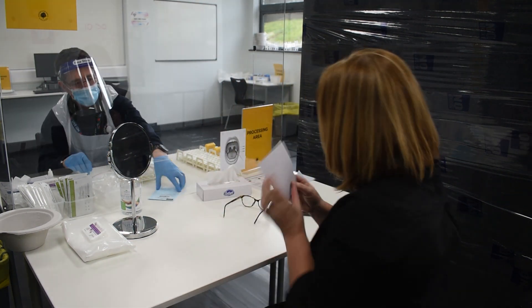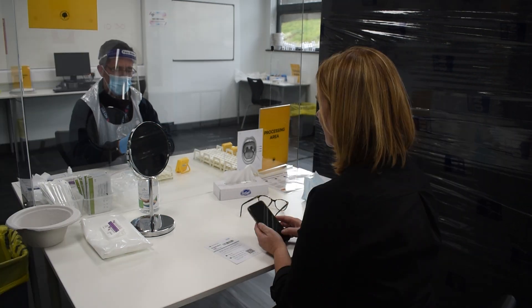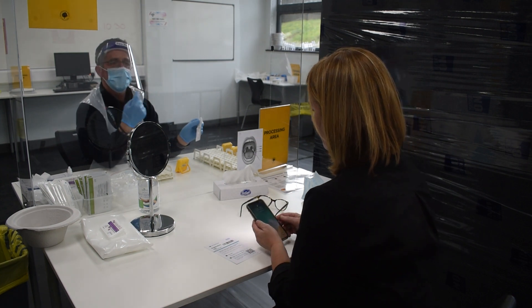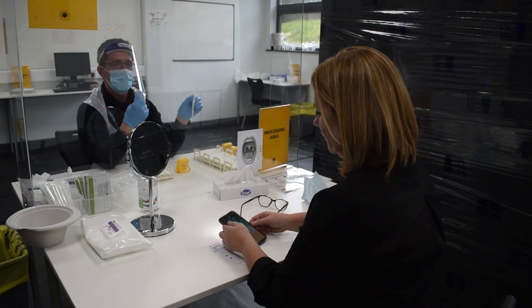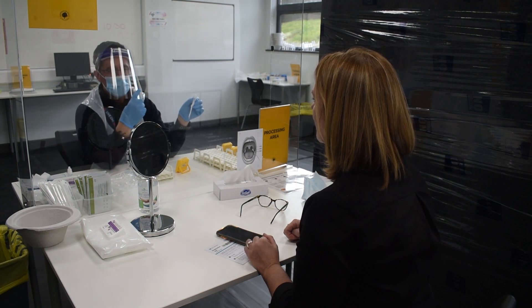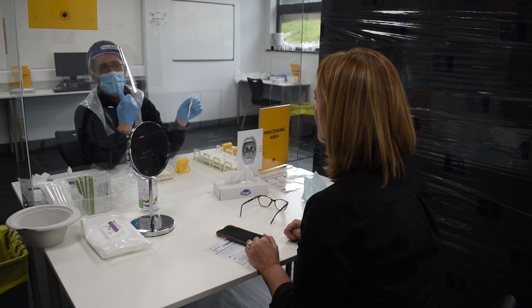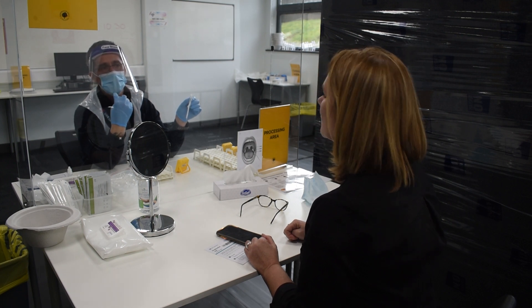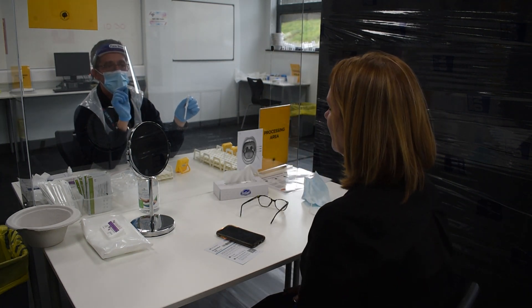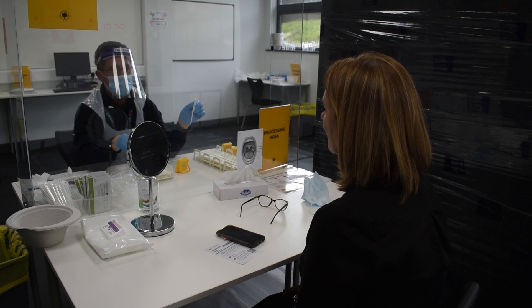So this card is for my own records. I'll pass you the handle end — there's the swab. Place it to the back of your throat where the tonsils are. Avoid touching your tongue, teeth or cheeks. Then scrape one tonsil three times and then the same on the other tonsil. Then up and off from whichever nostril until you meet some resistance. Twist it around five times and then I'll ask you to put it back in this vial.